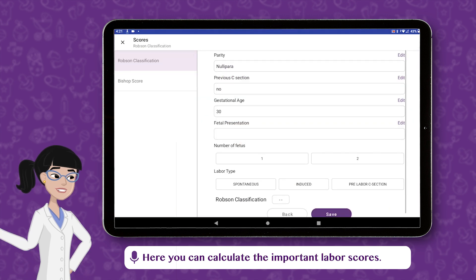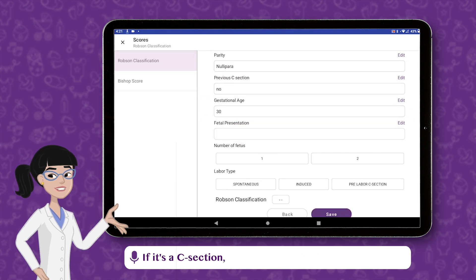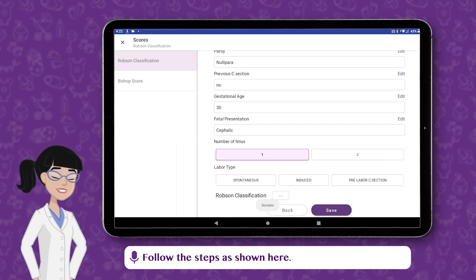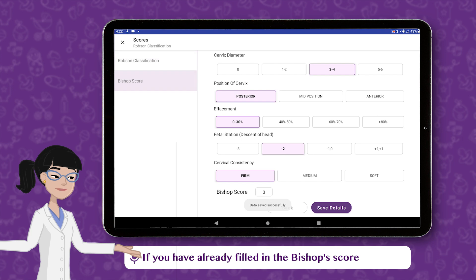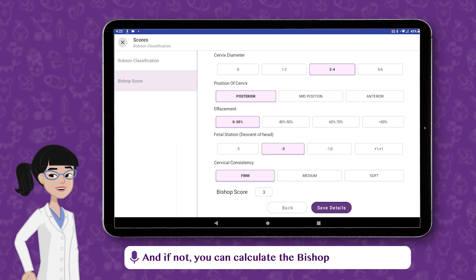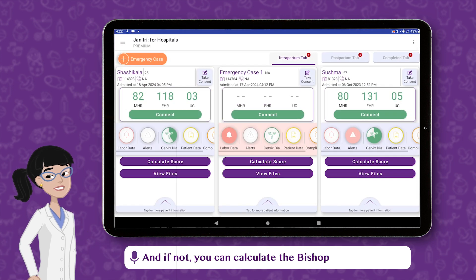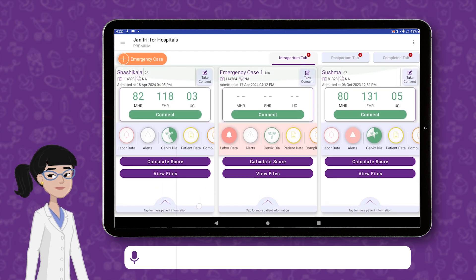Here you can calculate the important labor scores. If it's a C-section, you need to fill the Robson score. Follow the steps as shown. If you have already filled in the Bishop score before, the details will be saved here. And if not, you can calculate the Bishop score here as well.